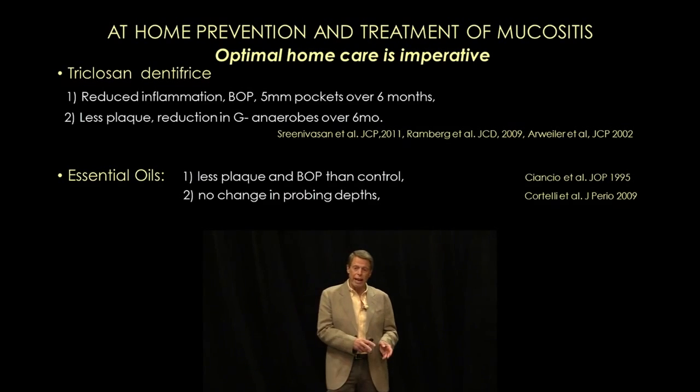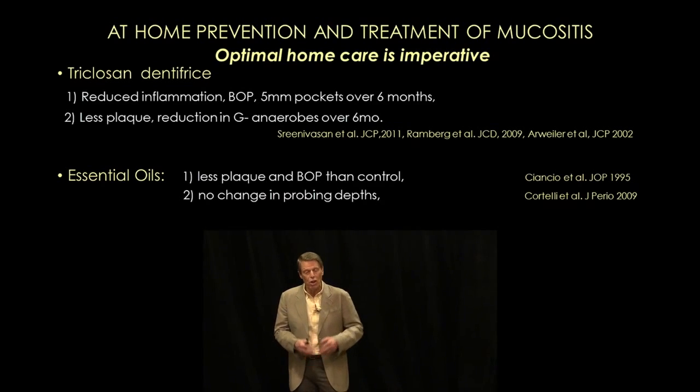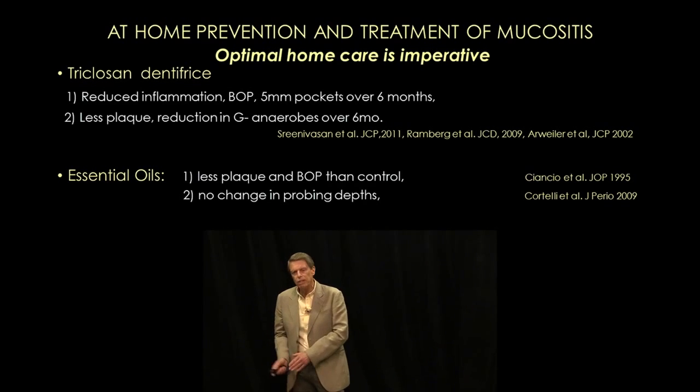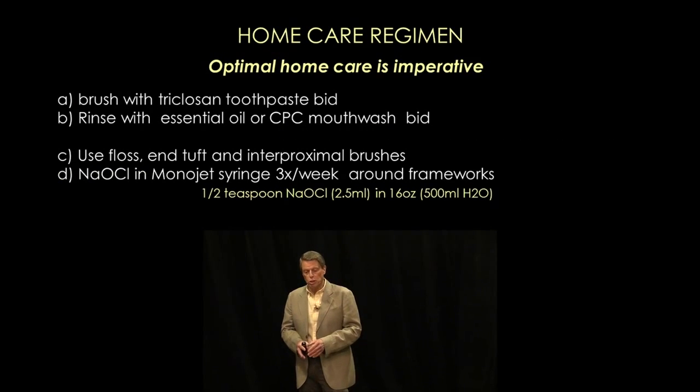The second thing we're going to ask them to do is simply rinse their mouth. We're going to ask them to rinse their mouth with an essential oil mouthwash. Again, in the United States, that happens to be Listerine mouthwash. And there's plenty of research that shows the efficacy of Listerine mouthwash. So optimal home care is imperative.